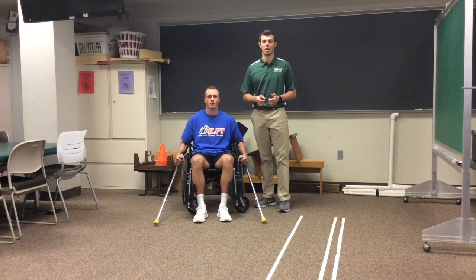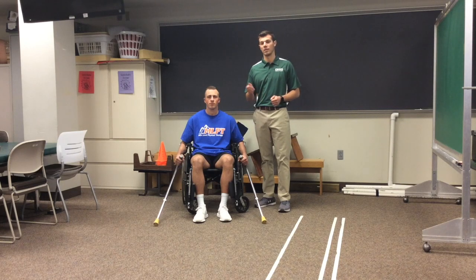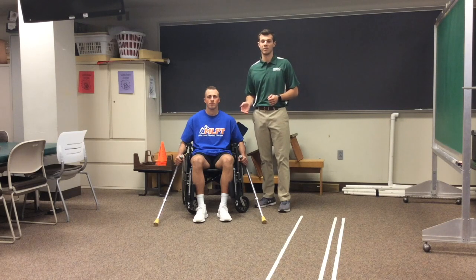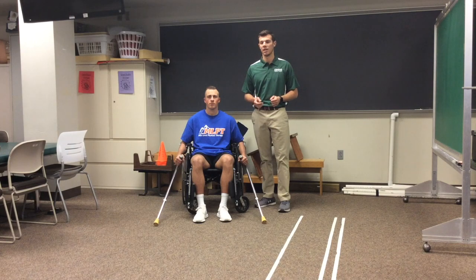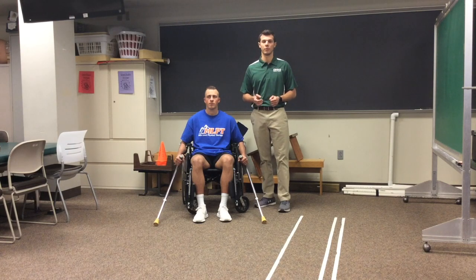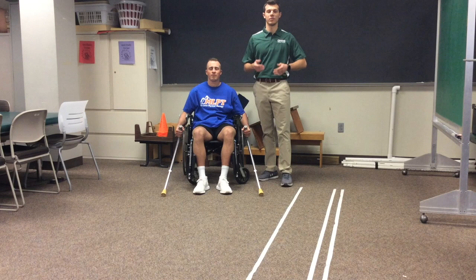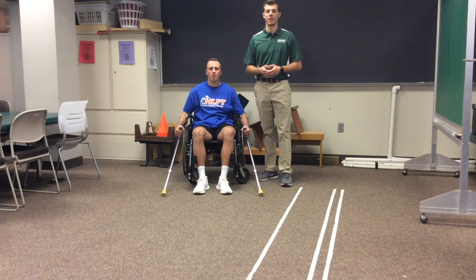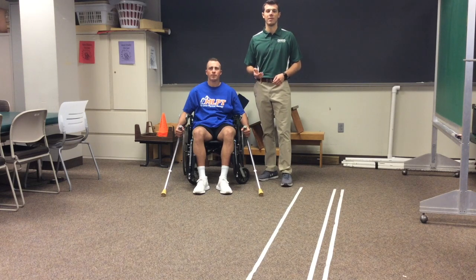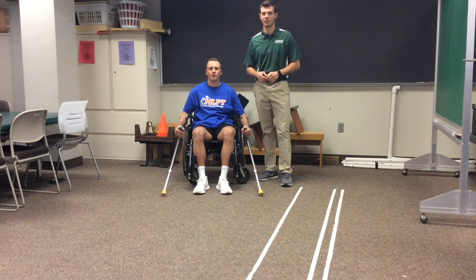Fitting of the Lofstrand crutches and learning how to go from sitting position to standing position is covered in Josh's video skill 36. When teaching the patient a new gait pattern, be sure to demonstrate that pattern for the patient. This is what I'll be doing next.